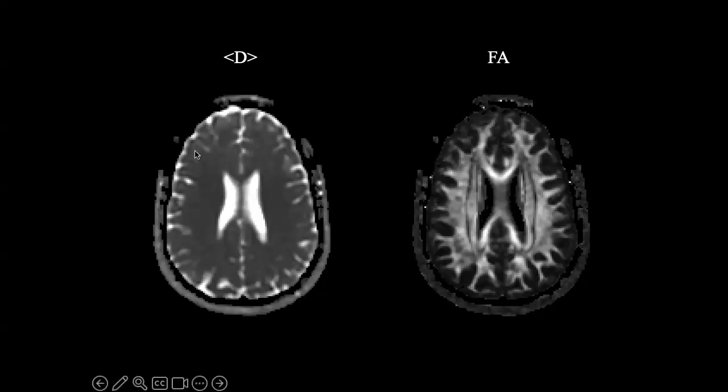So here's the mean diffusion coefficient. It looks like the ADC map. And then fractional anisotropy here shows a difference in the white matter and the gray matter. In addition, even the white matter has some heterogeneity within it, and this is because the direction of the white matter is not consistent within some of those voxels. So you can see here it's very anisotropic because they're all nice and coherent, but in this area we're going to have more than one direction of that white matter going in different directions. So now the anisotropy is low because it's all partial volume, it's all combined in that one voxel.